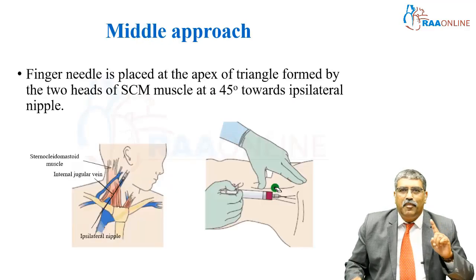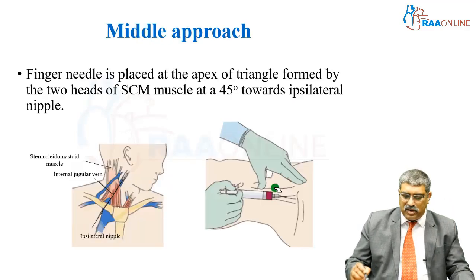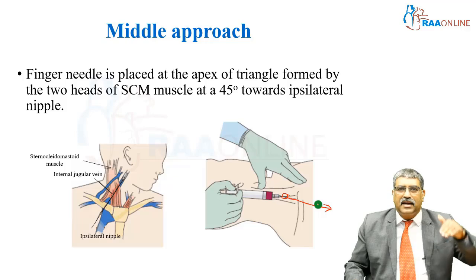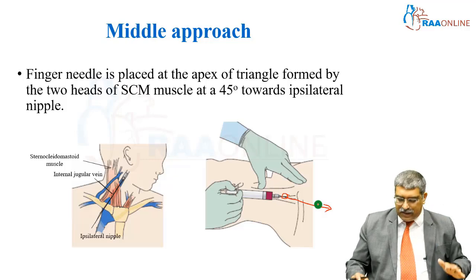Now, coming to the middle approach, which is the most common approach. Here, from the apex of the triangle, you go towards the ipsilateral nipple at an angle of 45 degrees.